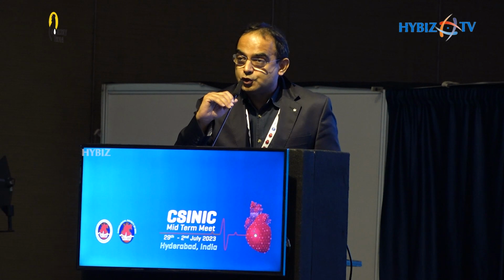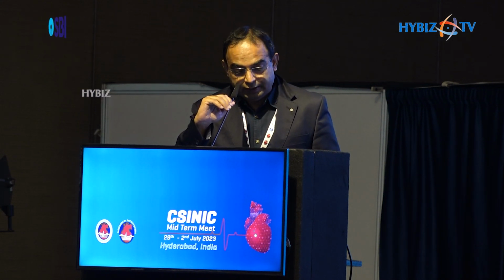So initially we put a distal stent, which was a 3 into 38 Xience Alpine DES. So this was the distal stent, and the proximal stent was 3.5 into 23, from ostial LMCA to LAD, overlapping with the distal stent. And this is the angio we took after implanting these two stents from LM to LAD. And this is the circumflex, the ostial circumflex. It looks optically definitely pinched.